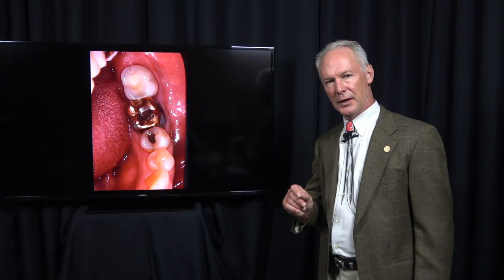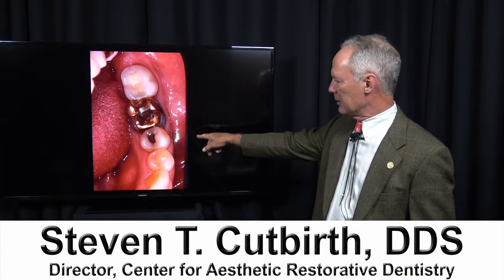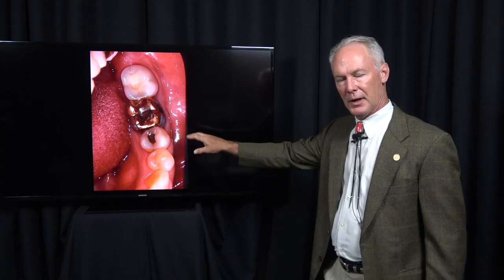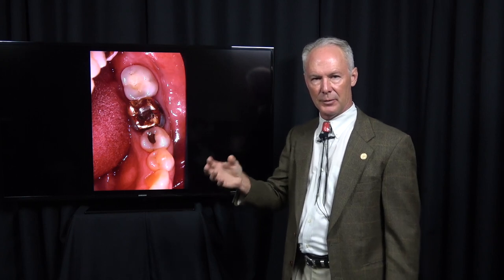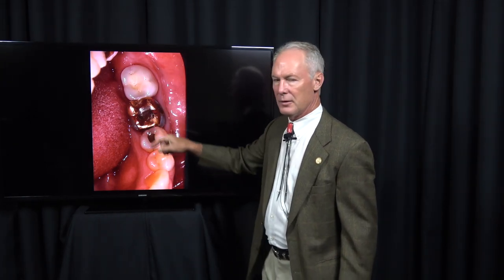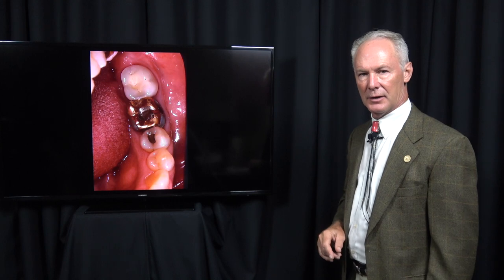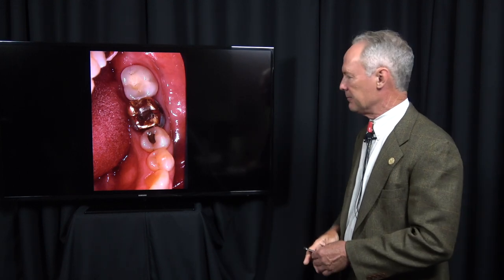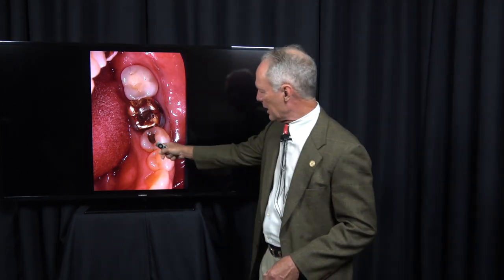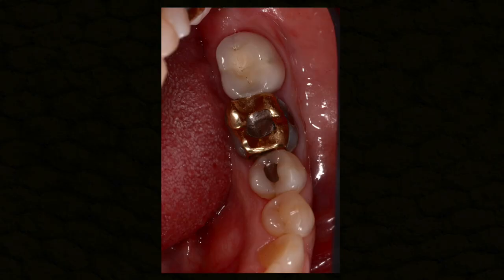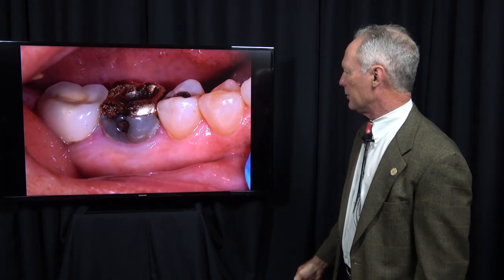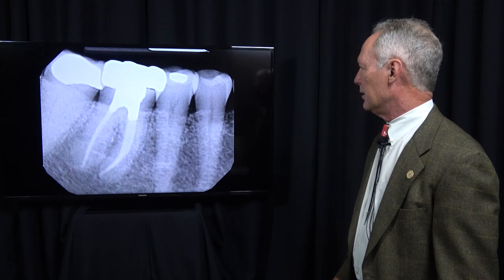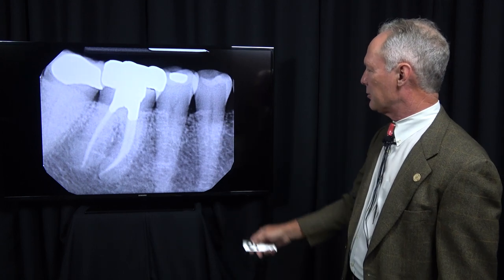Crown preparation on a mandibular first molar and second bicuspid with a composite base following crown removal and tooth preparation and removal of a crown from the first molar tooth. You can see the crack, the large crack on the second bicuspid. Significant decay under the old crown on the first molar. Lots of leakage. That tooth had had endodontics previously.